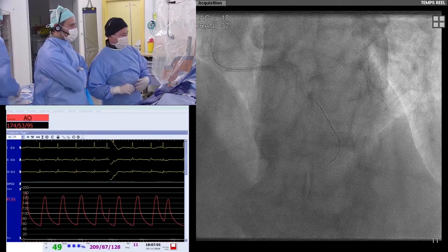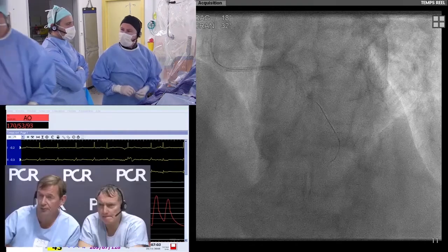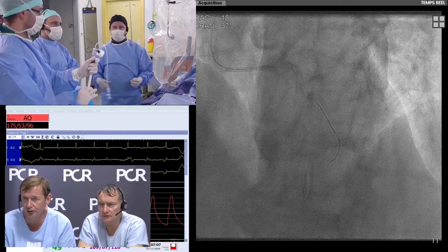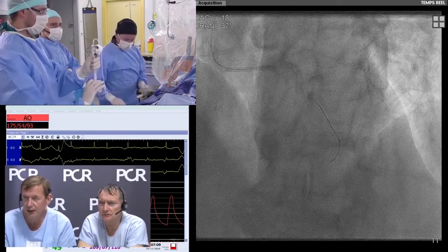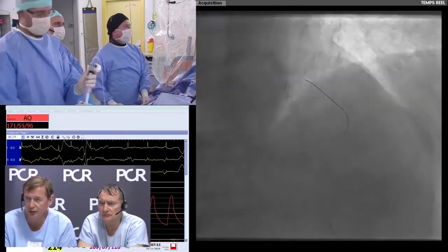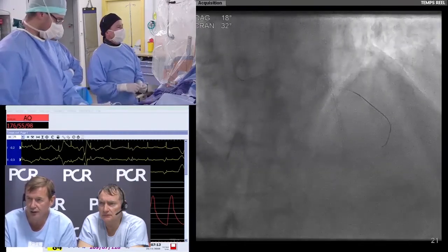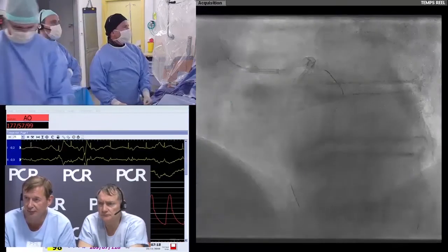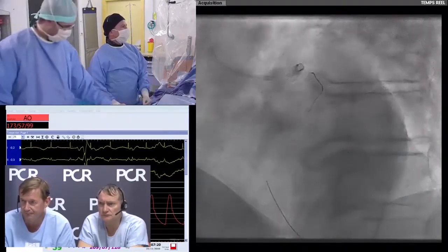It's a common myth that people think that calcification protects you from perforation. But you need to be very careful and make sure you do get your sizes correct, as balloon perforation post-rota and stenting can still happen. Right.